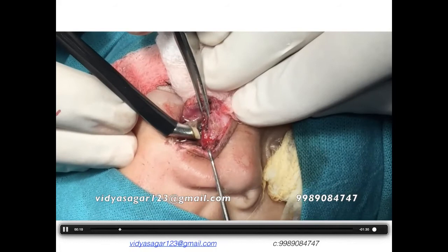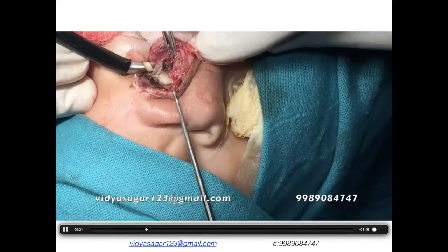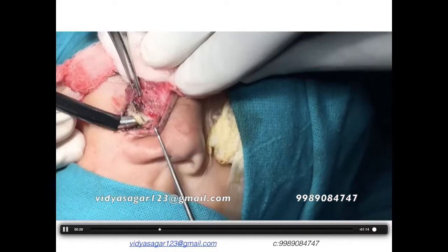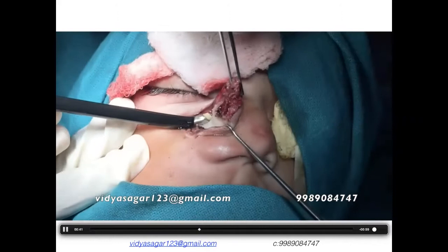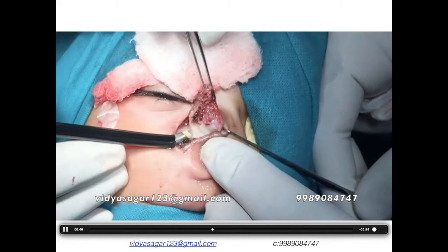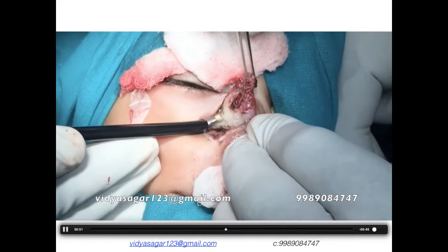I was initially worried about not getting a plane and skeptical about bleeding in a vascular mass — it was a lobular capillary hemangioma. But on the contrary, we got a beautiful, completely avascular plane where we were able to separate the lesion from adjacent tissues and separate this vascular neoplasm from its bed.